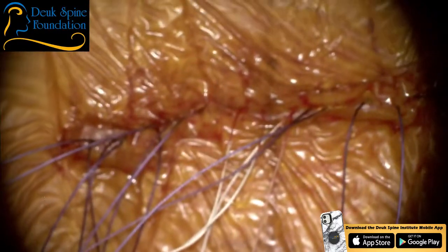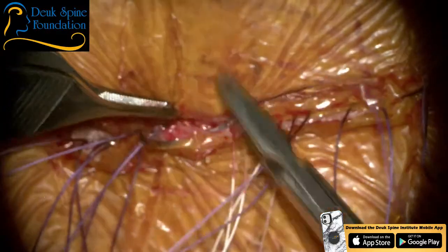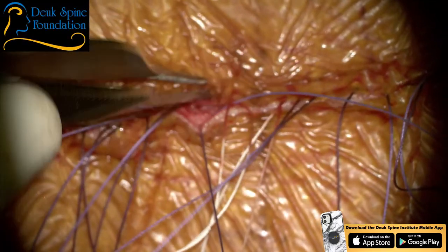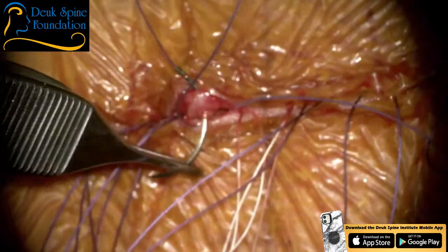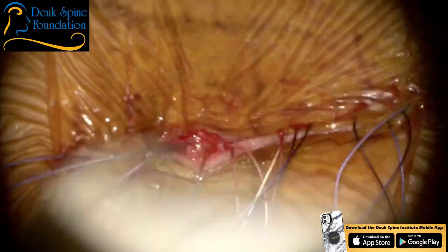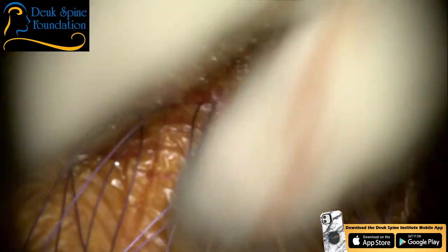Let me just check the suture line. Yeah, maybe one more here. And the pickups I'm using are called Adson pickups. They're pretty standard. They have a little tooth, and they have serrations. The serrations grab the needle. The tooth grabs the skin. They have some without serrations. I don't like them because the needle starts flopping around everywhere. All right.